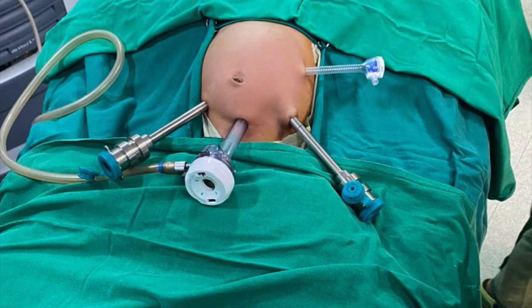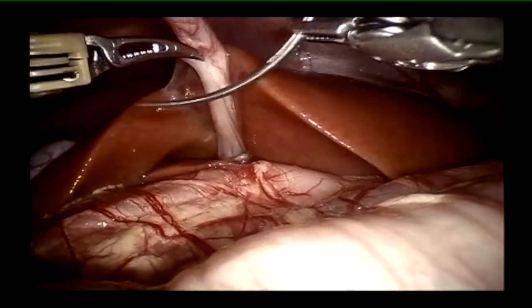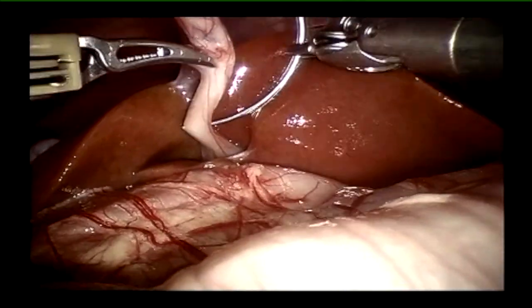To begin with, this is the port position. As you can see, it's a small baby — there is always going to be a paucity of space. That is why we place the camera port away from the umbilicus, almost in the suprapubic region, to get a panoramic view. This was the docking position of the robot; docking was done from the head end with adequate padding given to the head so the child does not have any problems.